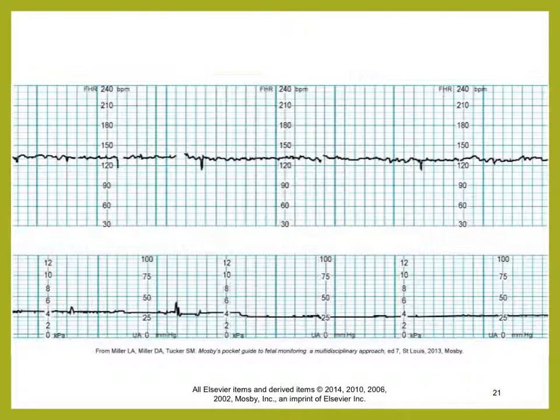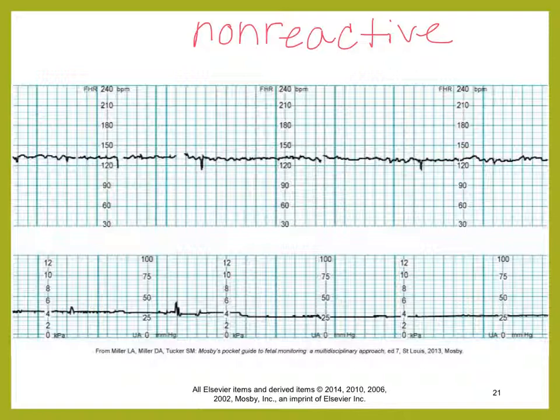Now we're looking at this strip in regards to the NST. This is a non-reactive strip. If you have a non-reactive strip, it needs further evaluation. It's extended for about 20 minutes or longer. If you have a mom who's in for an NST and it has been 40 minutes and it does not meet the criteria, they are going to do a BPP. So they are going to gather more data to determine what's going on.